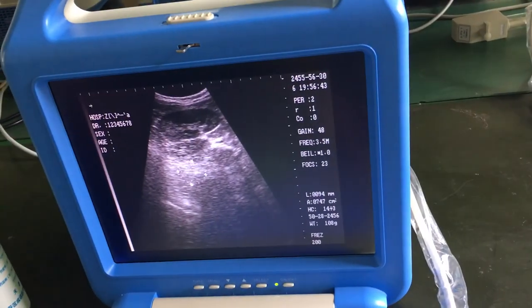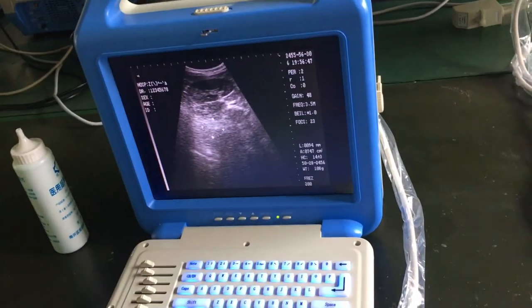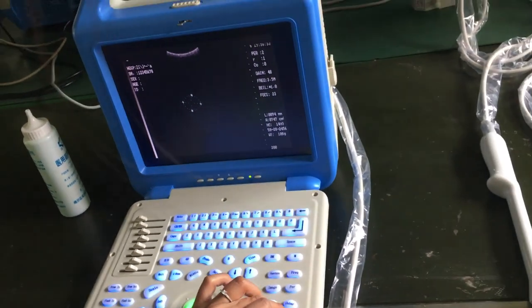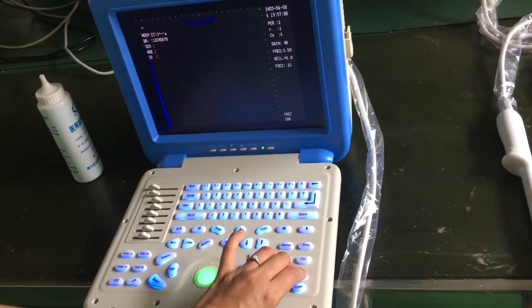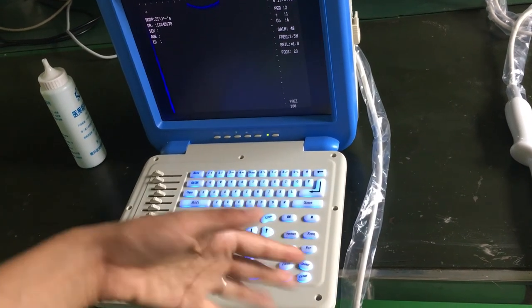Now we press the color button. This is pseudo-color mode — it shows the image in different color screens.